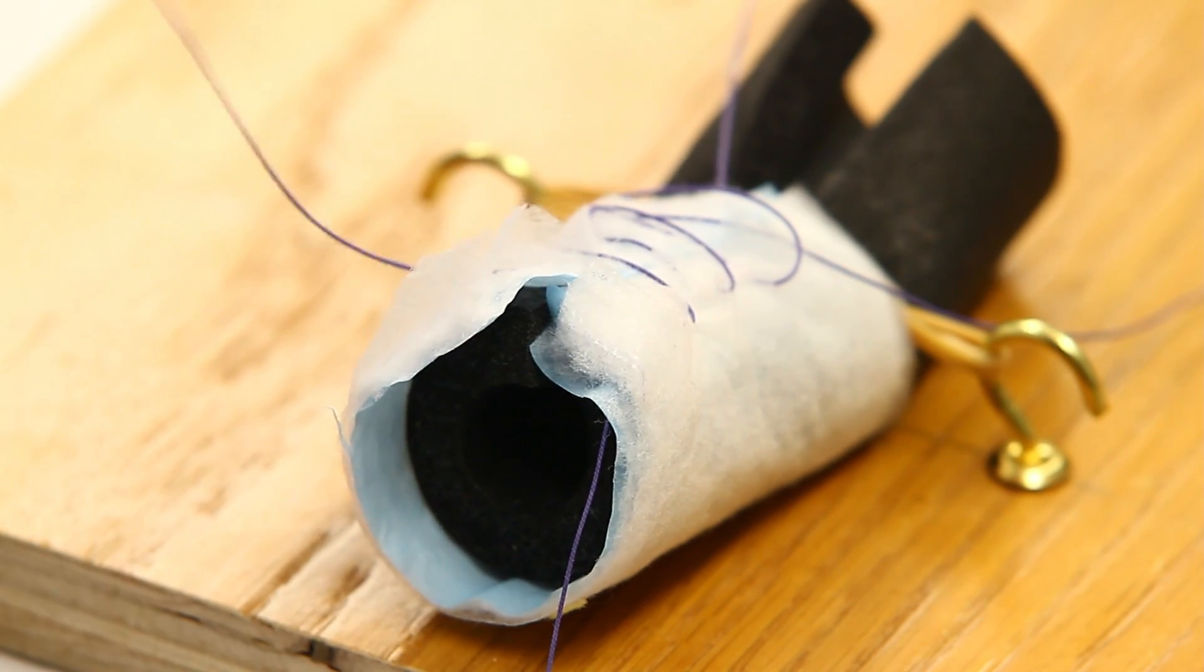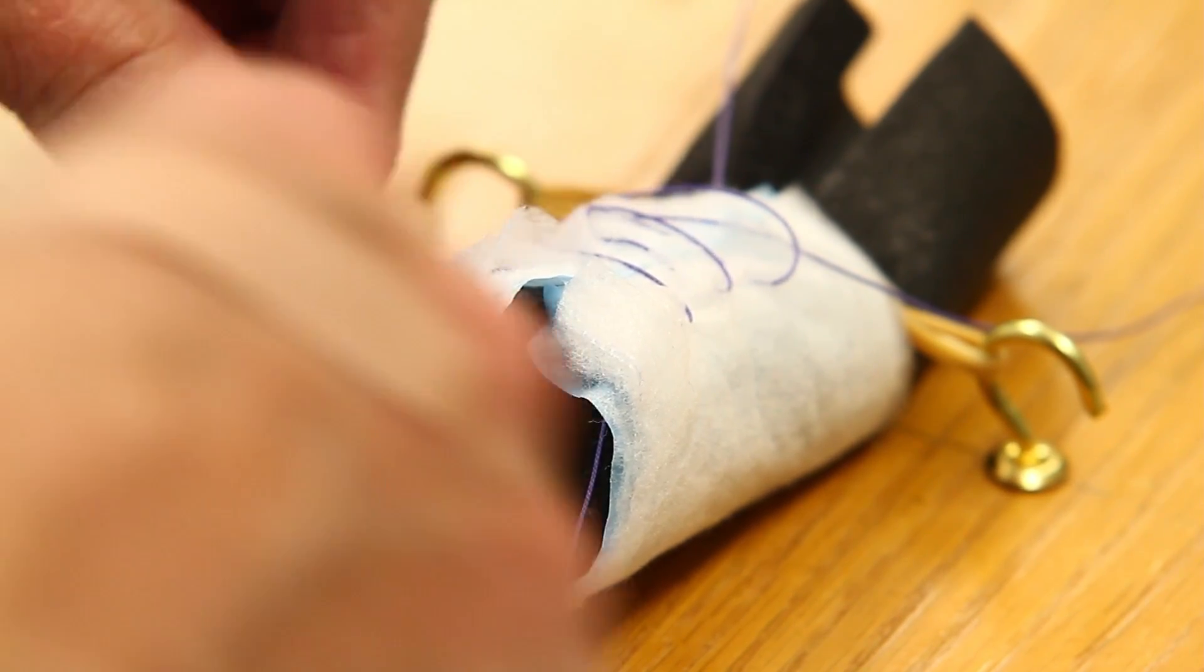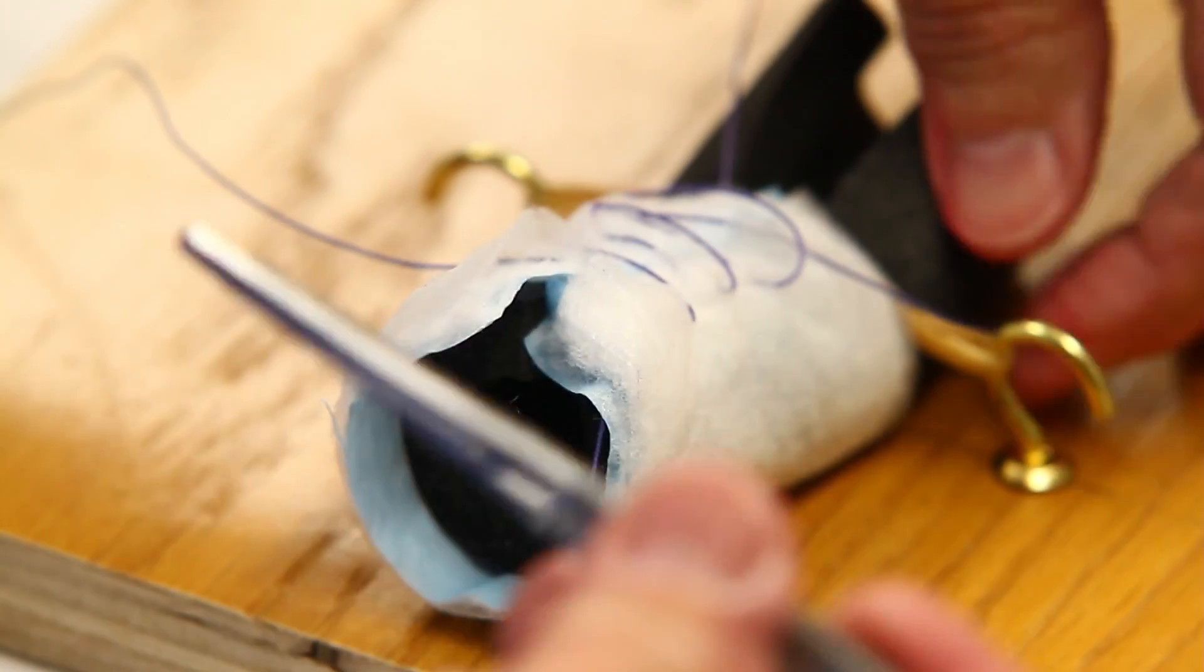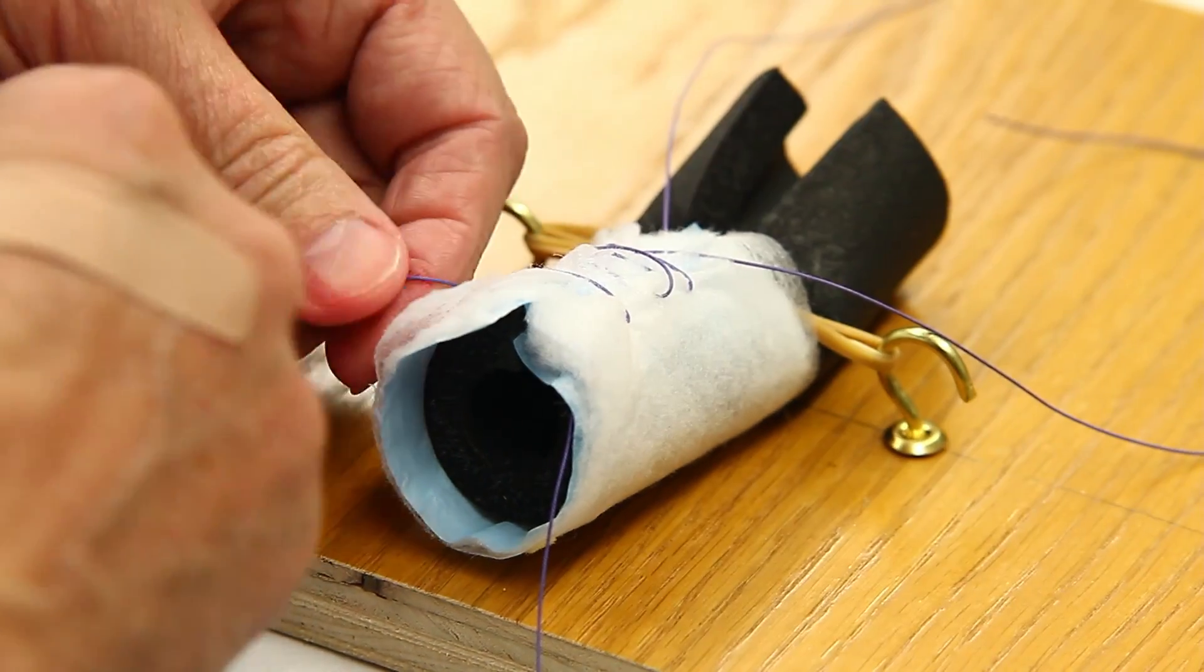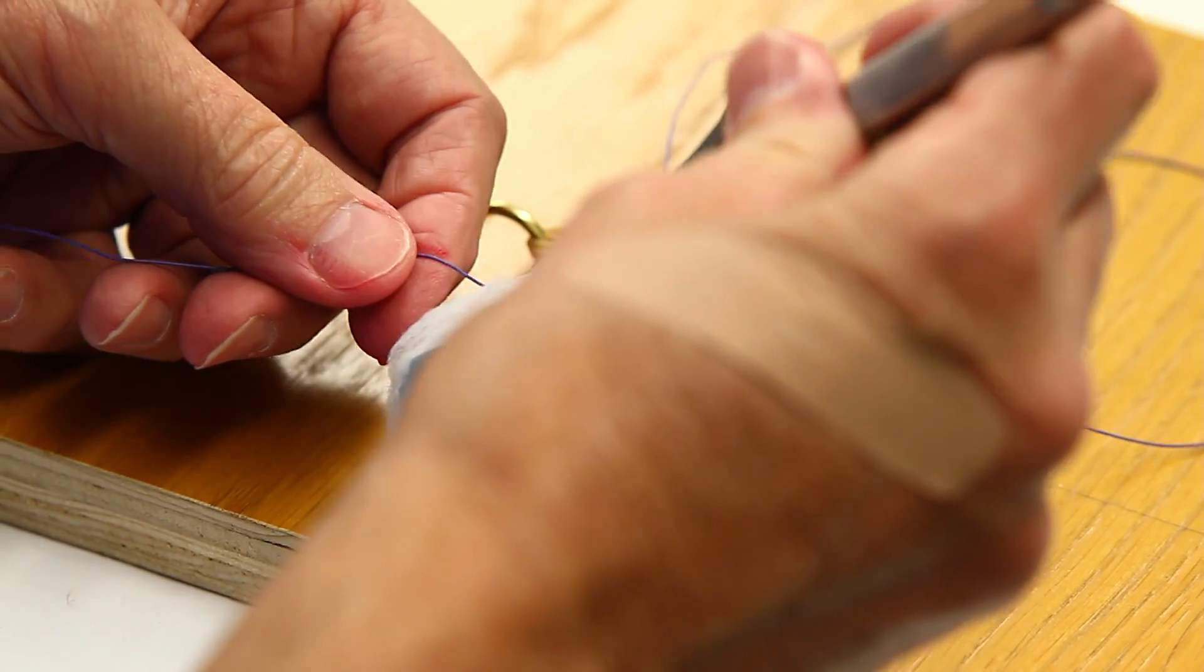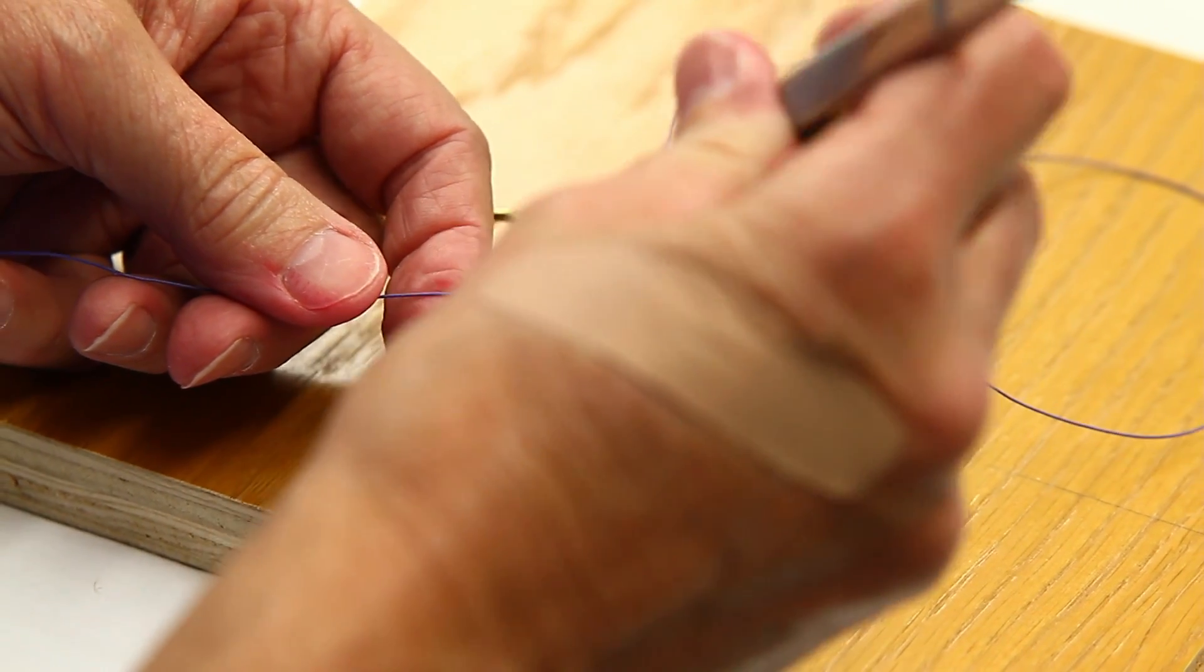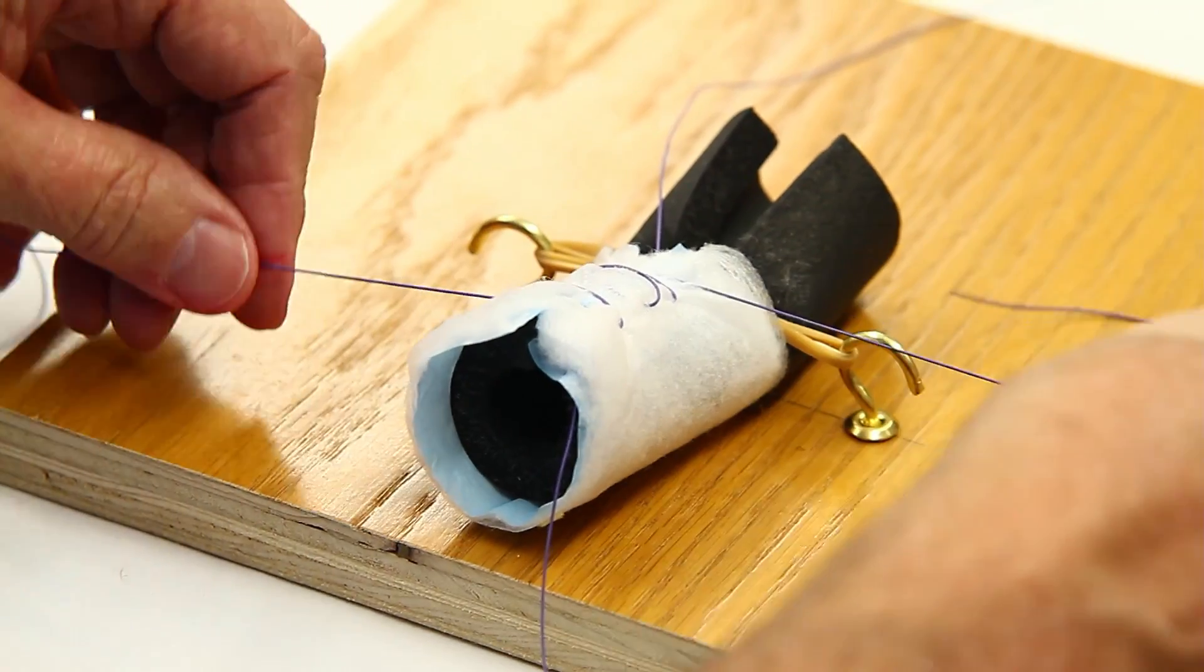Okay, so there we go. And you can gradually tighten this up. So it's actually possible to repair this layer. It takes a lot of patience. It takes a delicate touch. You have to follow your needle curves. And there we are, repaired.